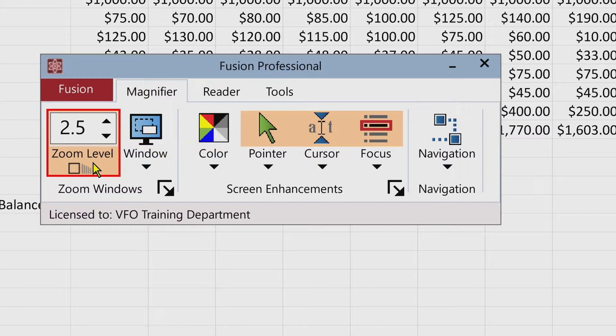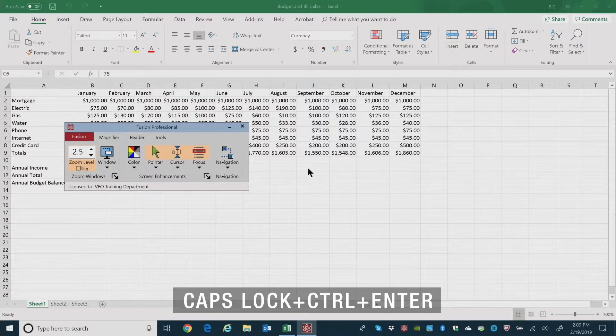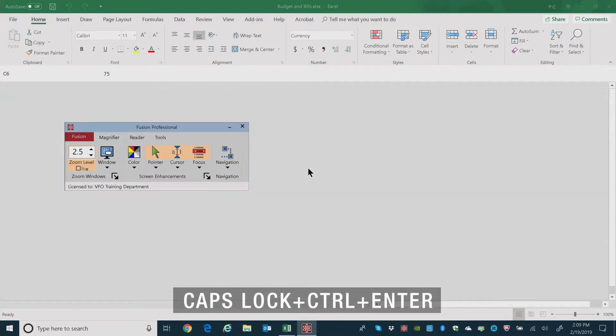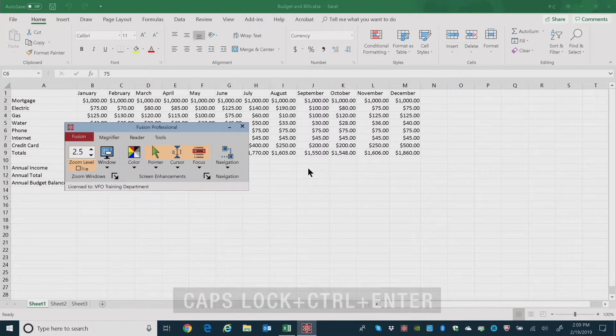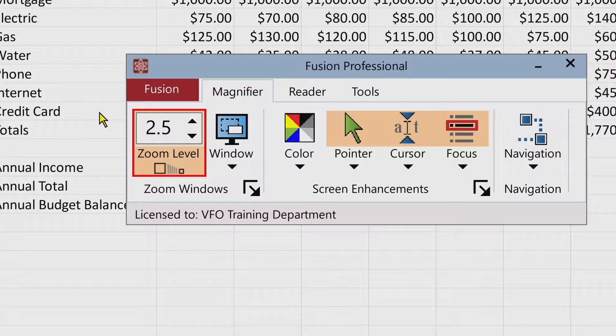Enabling and disabling Fusion is also a toggle keystroke. You can enable or disable Fusion at any time without closing the program by pressing the Fusion on/off hotkey: Caps Lock + Control + Enter. That zooms out to 1x with no enhancements visible. Press it again to return to normal.